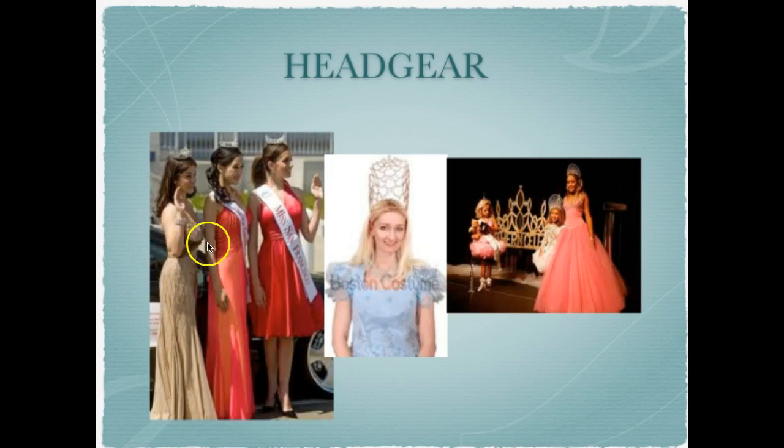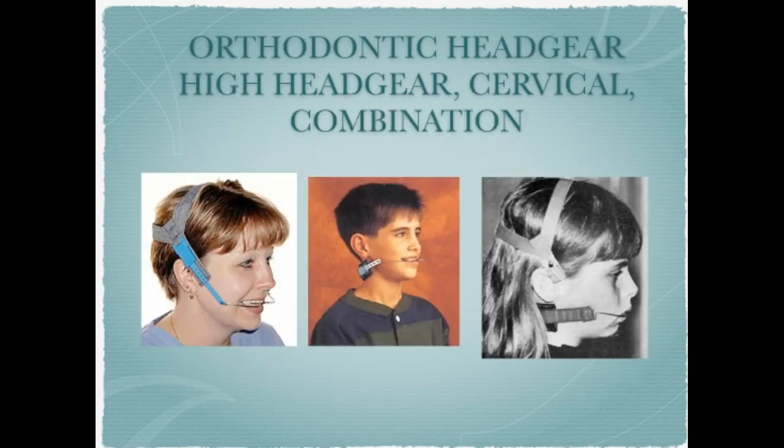Then we also have headgear. Oh, not this type of headgear. This type of headgear, orthodontic headgear. We have one known as a high headgear, a cervical headgear, and a combination.